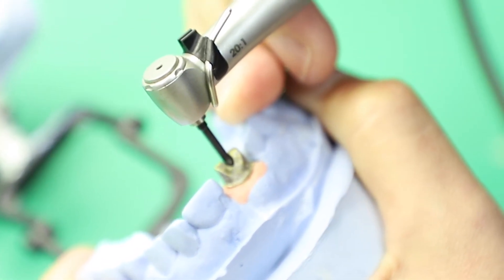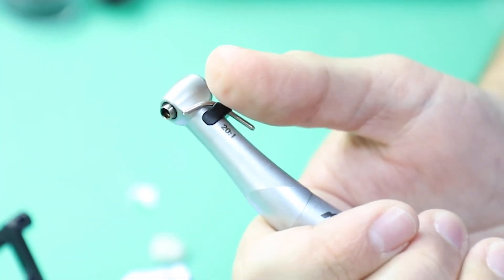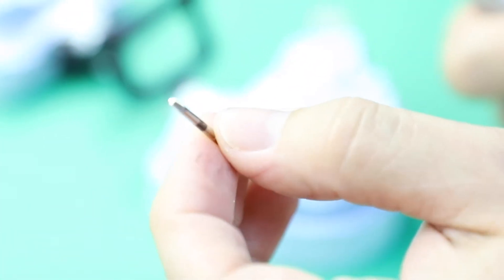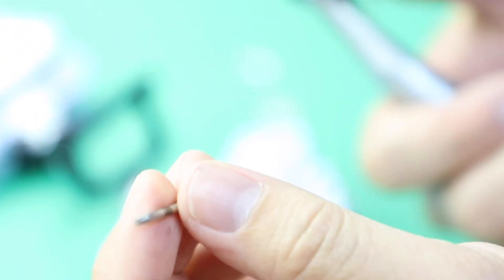I'm going to go up and down. It's pretty hot, so you want to make sure to use irrigation. The next one you're going to use is this one — this is a tap, and you're going to run this on reverse at about 50 newton centimeters.